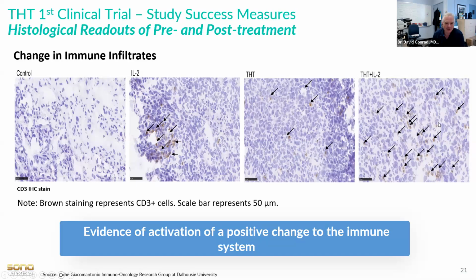Yeah, so I agree. This is showing what we want our immune system to do to fight a cancer. It's being boosted by the THT, and even more so when THT is coupled with IL-2. Yeah. Excellent.